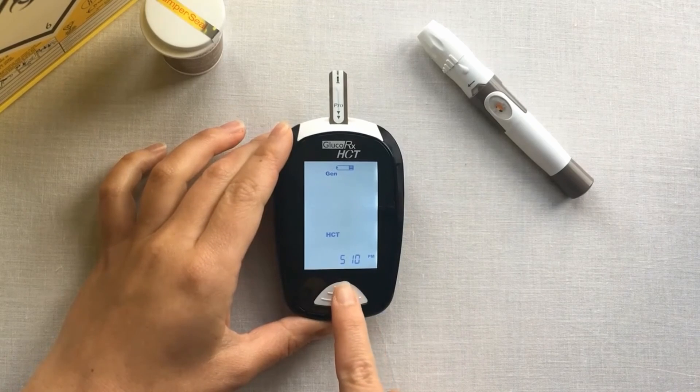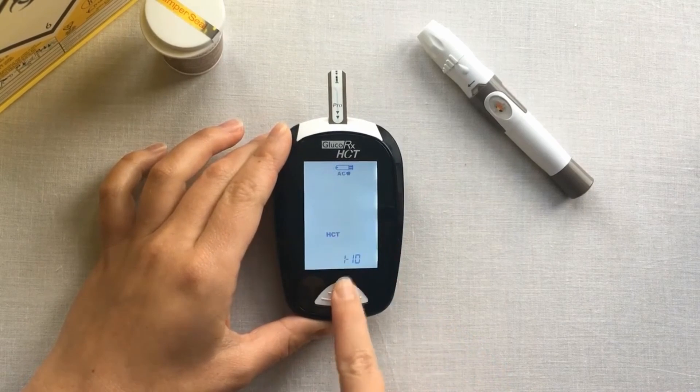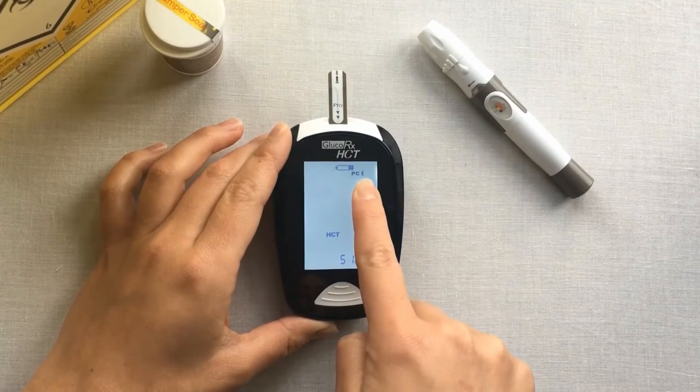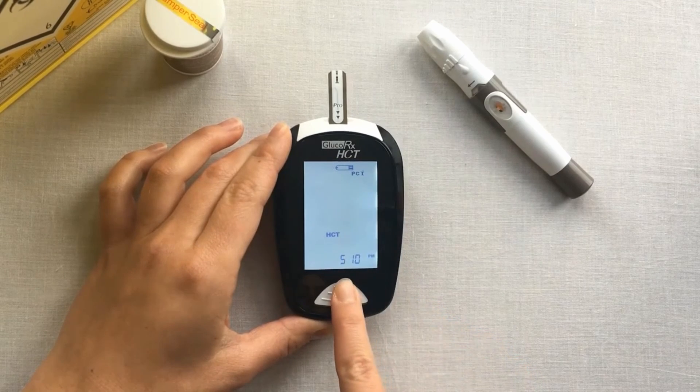Select your meal markers by pressing the middle button. General mode, AC before a meal full apple, PC after a meal eaten apple.